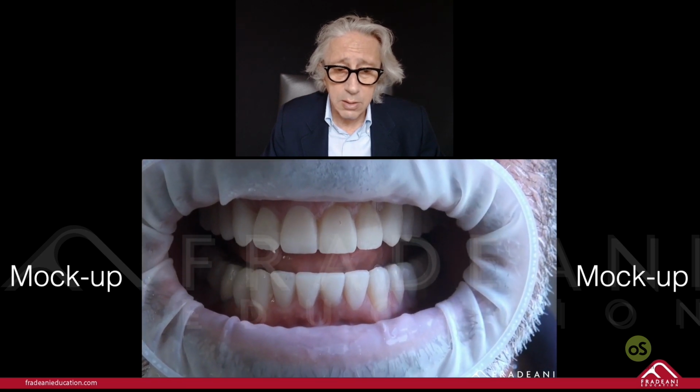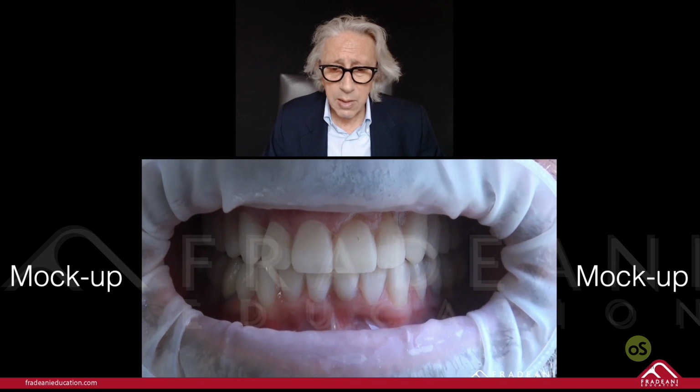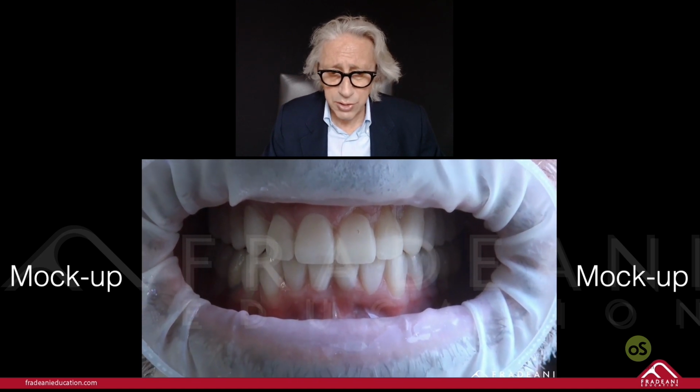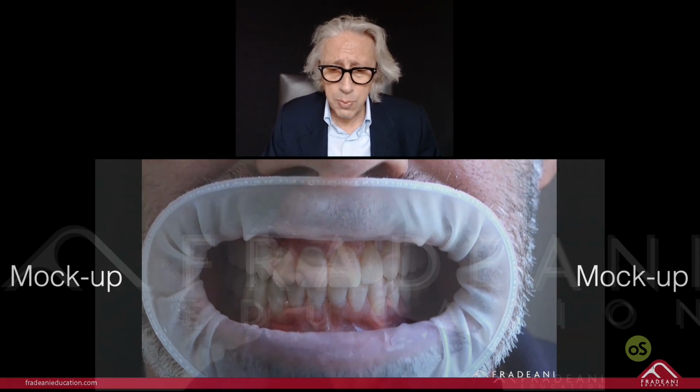Maybe it's good, maybe not. We don't know. But he didn't see himself yet. Actually, we did just some little modification on occlusion, very little, and that's what's done. The mock-up was practically perfect.